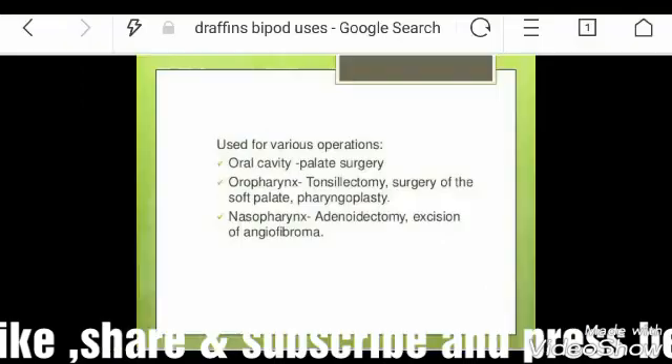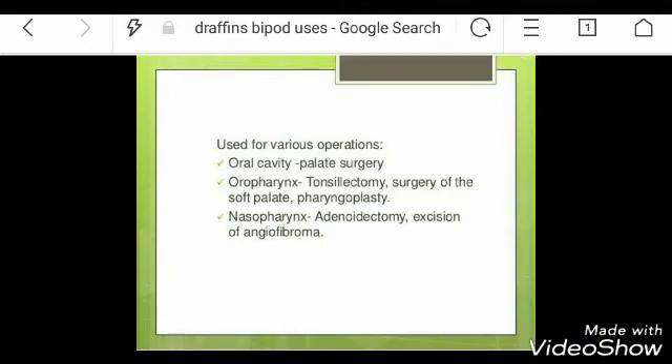It is the Draffin's bipod, used alongside the Boyle Davis Mouth Gag. Each bipod has four rings, used to vary the height at which the tongue blade of the Boyle Davis Mouth Gag can be suspended. Indications of both instruments — please read them.